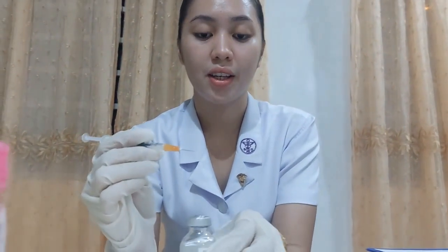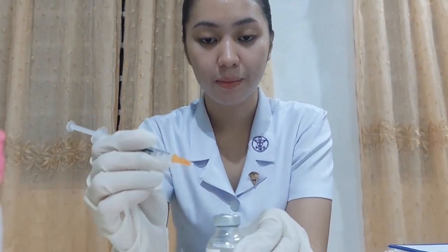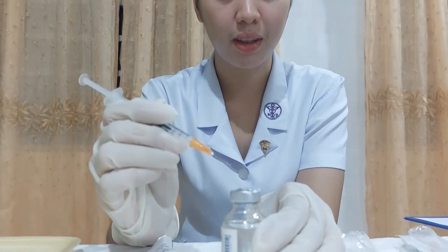Okay, so now that we have withdrawn air, I'm going to inject the needle into the vial. We have to stabilize our hand here and steady our vial with our non-dominant hand. Okay, so we're just going to maintain sterility. That's why we're stabilizing our hand.